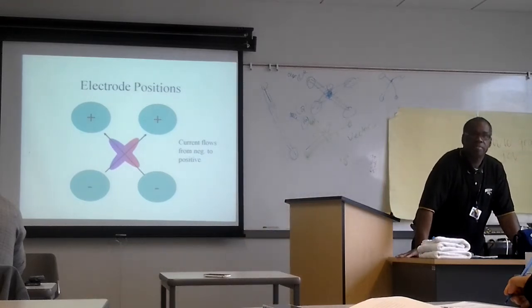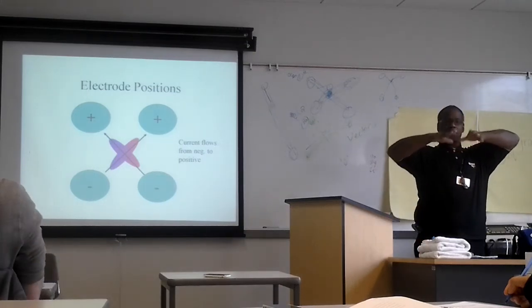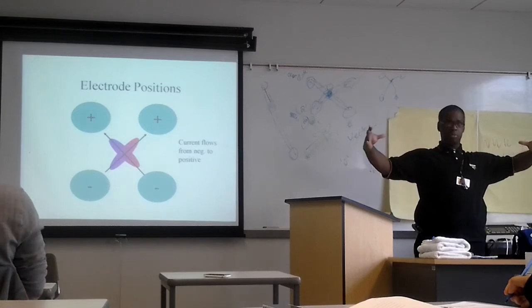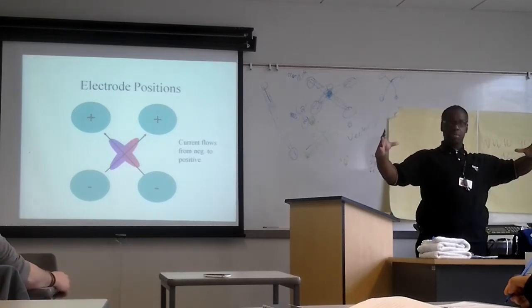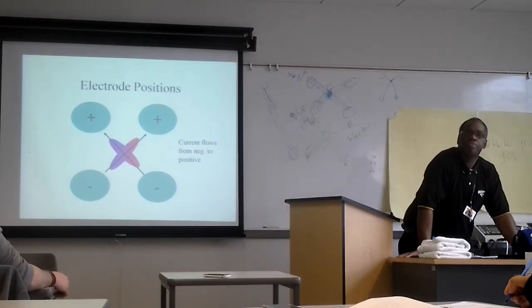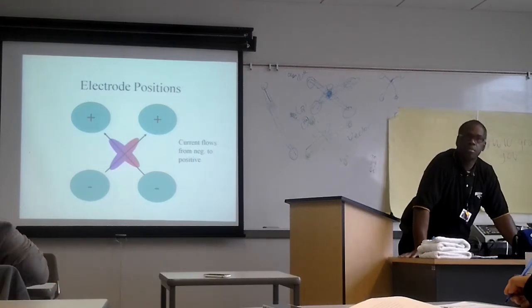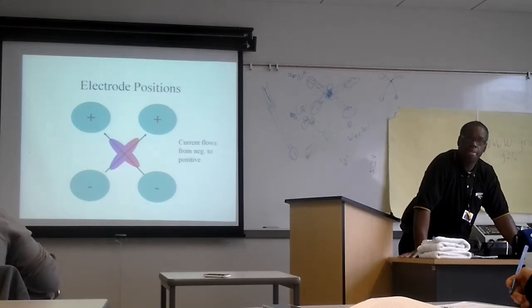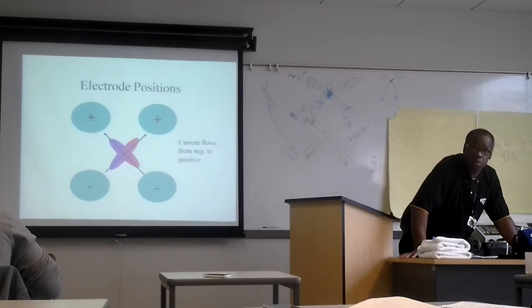Is it always focused on the deep muscle, or can you use it with superficial muscle too? Well, it still has the same concept. Close, superficial; spread, deep. But if we want to make it deep, we need to make sure that we send it in to be beneficial. If you're using it for an acute pain protocol with this quad polar setup, then you still can use 100 pulses per second, but it won't be effective to really treat deep.